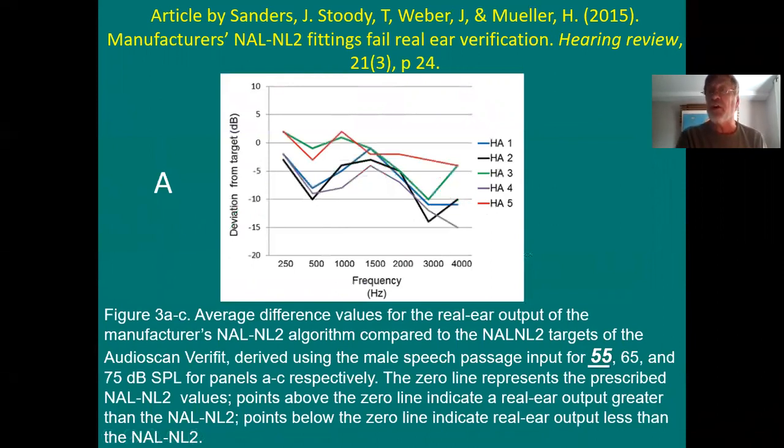So very important article summarizing in a better way than I ever could on my own what happens in today's hearing aid fittings and how utterly foolish it is to walk completely in the shadow of hearing aid manufacturers, letting them wave the baton and you just singing along. Best to really take control and follow up their fitting and do real ear and see it for yourself. Only then have you finished the fitting.